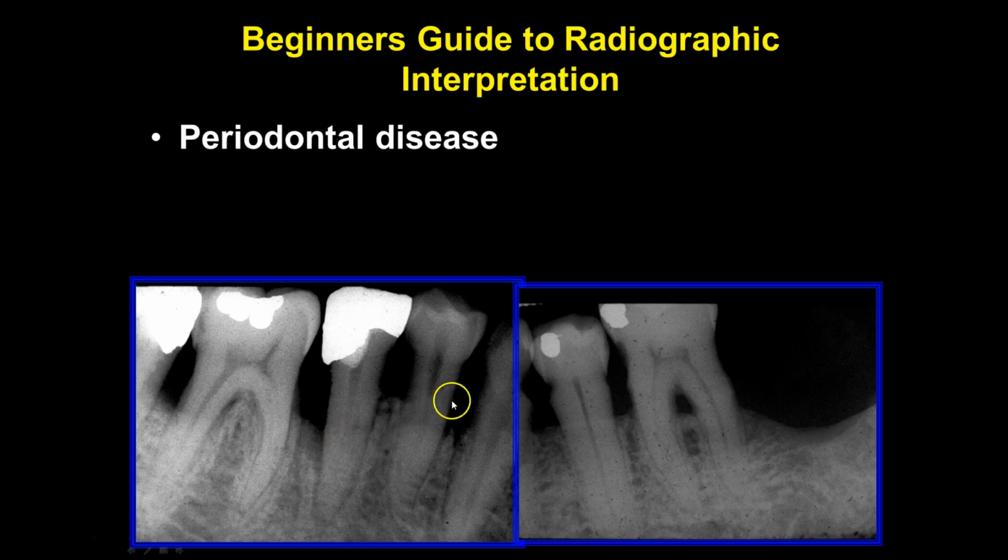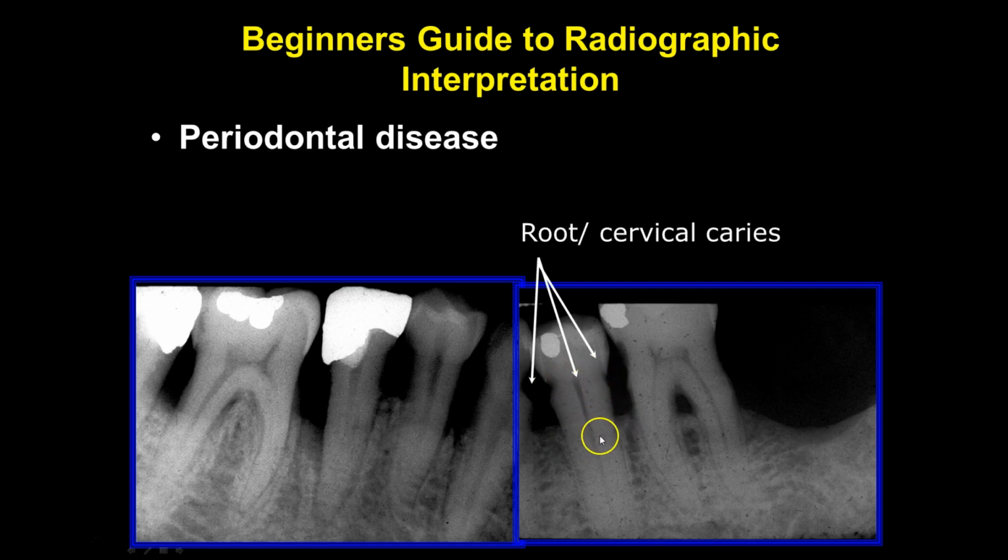So on over to the next slide here, we have some furcation involvement. This looks like radiolucent burnout, but more than likely, given the age of the patient, you can tell there's significant horizontal bone loss here, that there's probably some cervical caries here. And we were right. Cervical caries, very indicative of possibly an older patient that's maybe on medication that has caused some significant xerostomia, and we wind up with a thick, ooey gooey biofilm that's present around all the cervical or neck regions of the teeth, which is very challenging sometimes for patients to keep clean.